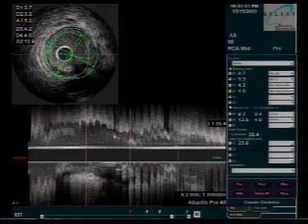This is a very important point, as Dr. Lauer is pointing out. In the old days, we used to balloon, injure a lot, long areas, and we used to put in very short stents, which we used to call long balloon focal stenting or spot stenting. And with non-drug-eluting stents, that's a pretty good strategy, and the results are reasonably good. However, since these stents themselves with the drug have virtually no reblockage, we're now changing to a strategy of putting in somewhat longer stents, and if we do have to dilate the vessel, staying totally within the stent and using short balloons. So we've gone from long balloons and short stents to long stents and short balloons. Sort of changed our philosophy about how to maintain the opening in these vessels.